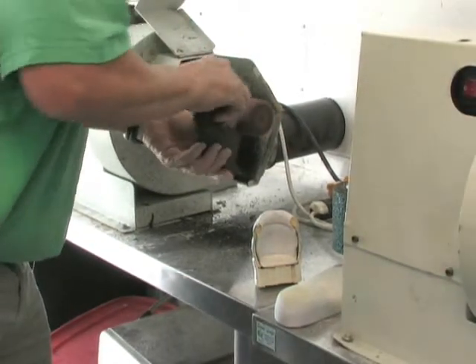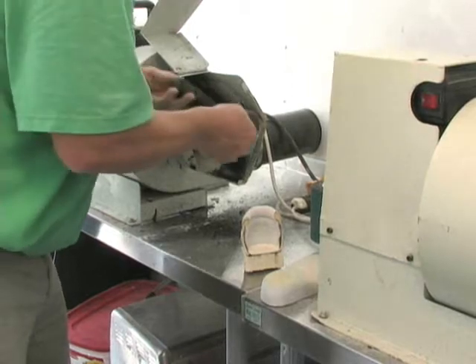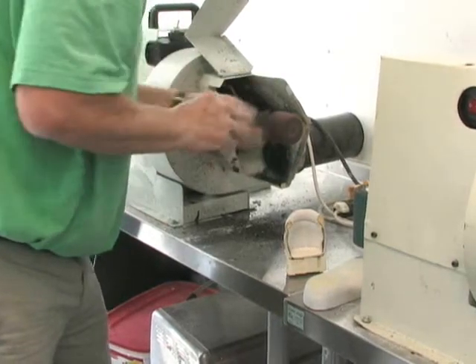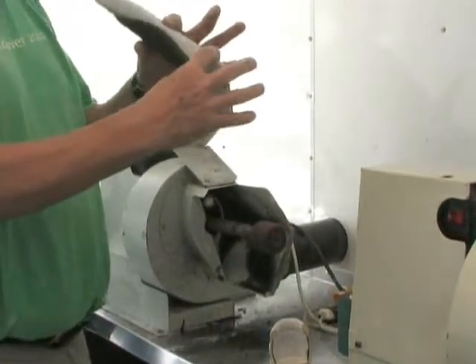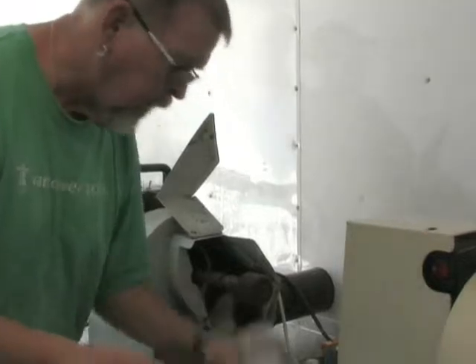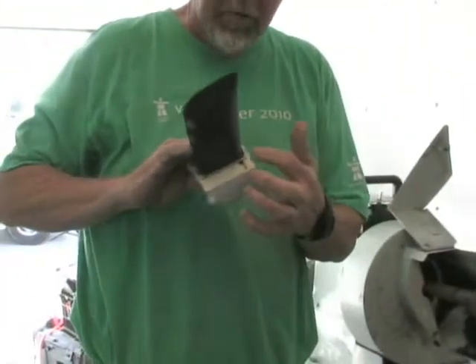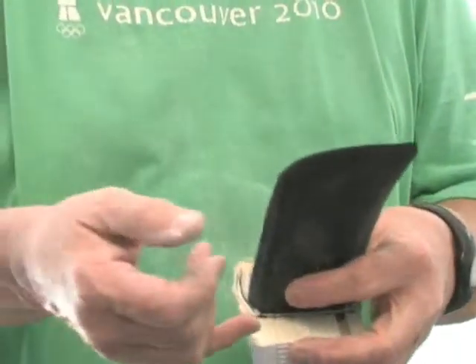A little bit of finishing work here just to make it look nicer. Now it's the cast — everything cuts in, it cuts nicely, doesn't interfere with the shoe, and does a nice job in terms of the contour. It fits in very well. The last step is to put a top cover on it and it's done.